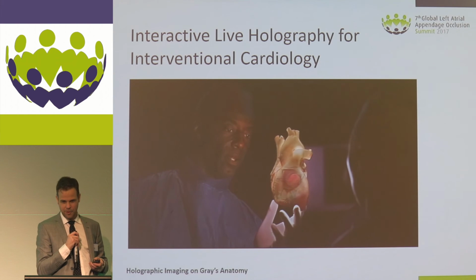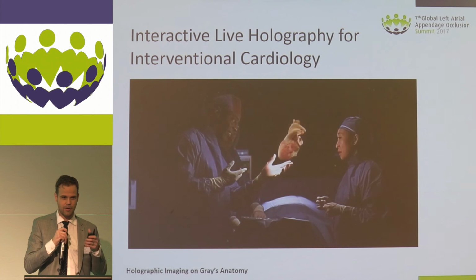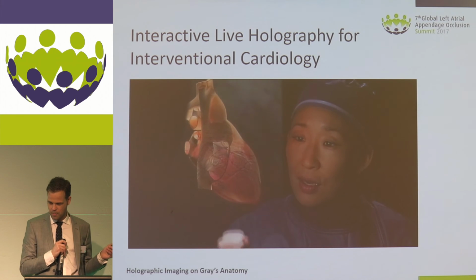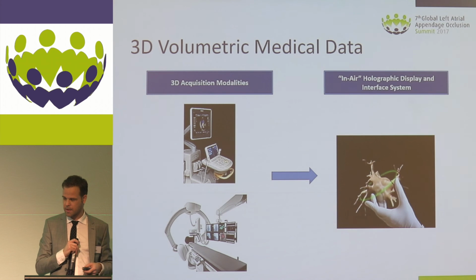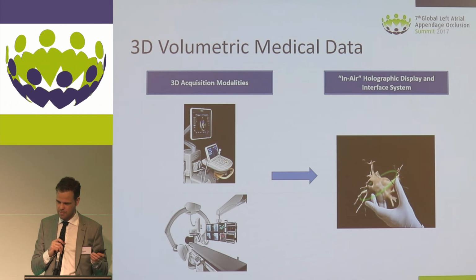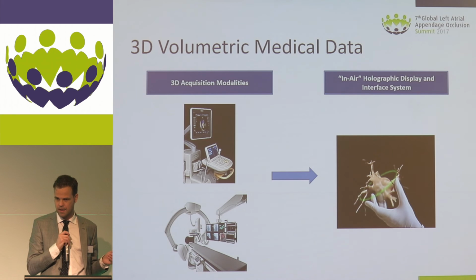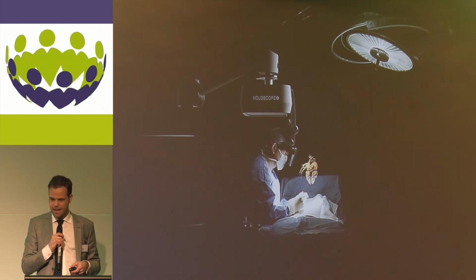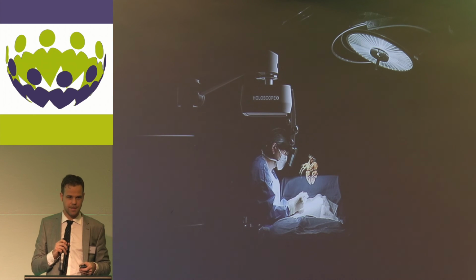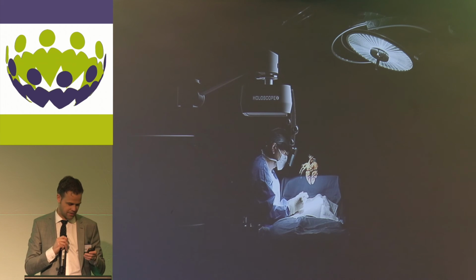So at that time, there was no real fusion, but already they predicted that we might be able to look at holograms during the procedure. But actually, this is becoming more and more realistic nowadays, where we can use the 3D capabilities of our Echo machine or CT, it doesn't matter, but Echo is of course live, where we get an in-air holographic display where we can interact. And the idea is that the interventional cardiologist at the end will get a sort of glasses before his eyes where we can switch on and switch off the holography during the procedure to have an idea what is going on in the patient.